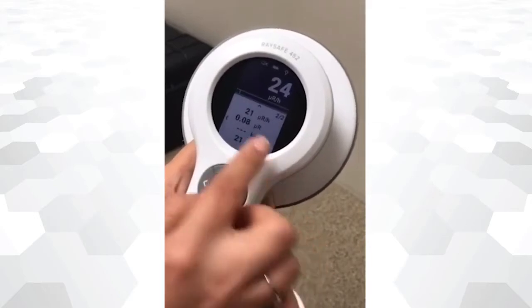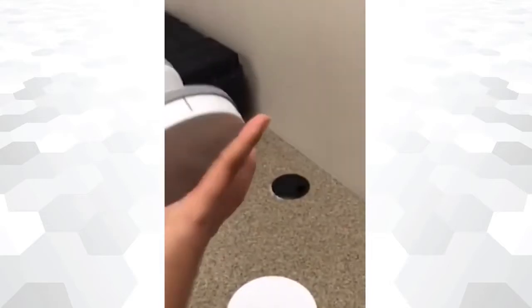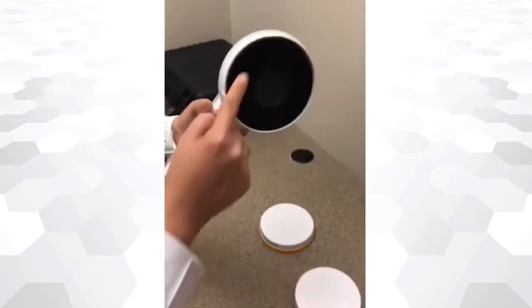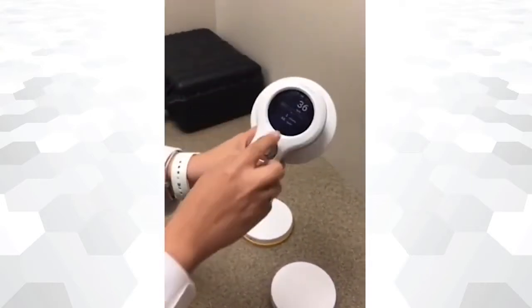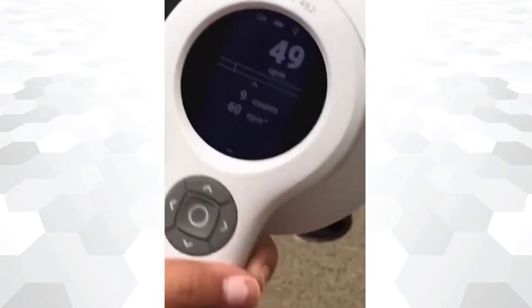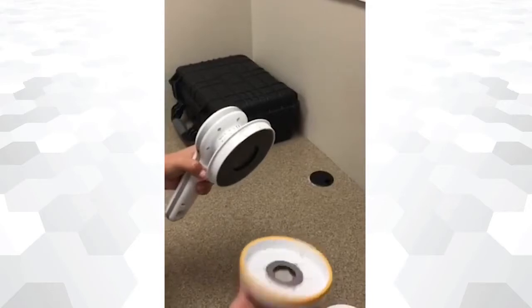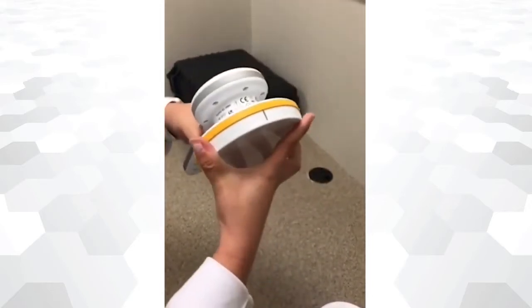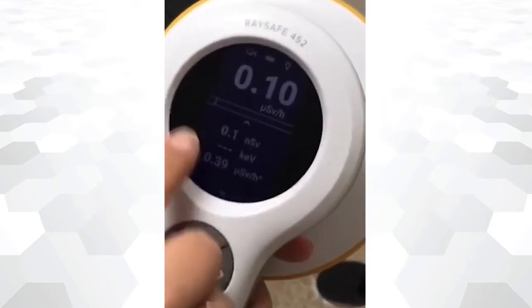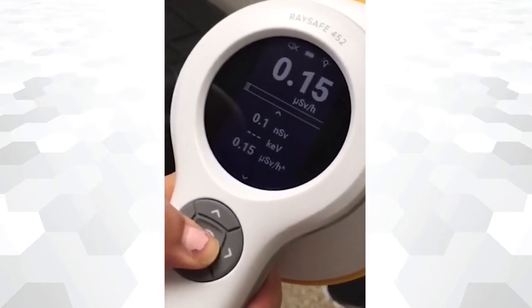Measurements are sorted in chronological order. If you want to view all measurements, use RACE-A 452 View software. To use the detector in Geiger-Mueller mode, no lid is required. The units for Geiger-Mueller mode are automatically changed by the system — no pre-setup is required. To perform ambient dose measurements, just place the yellow lid into the detector and start collecting your measurements. The device will automatically change its units.